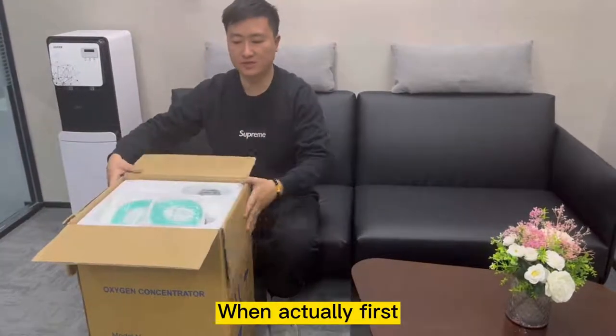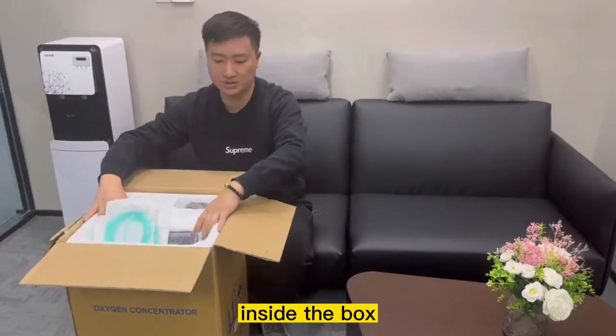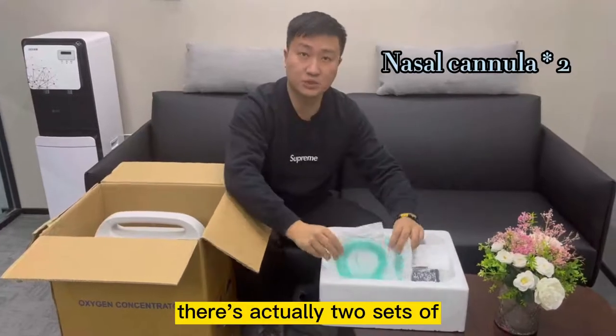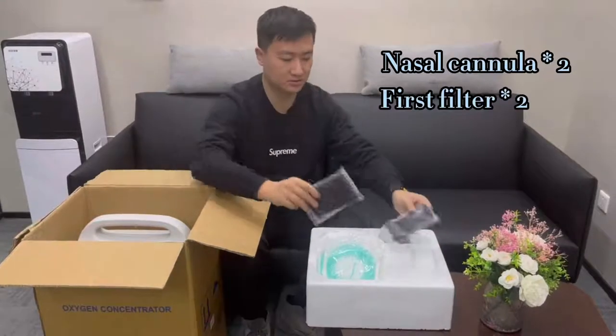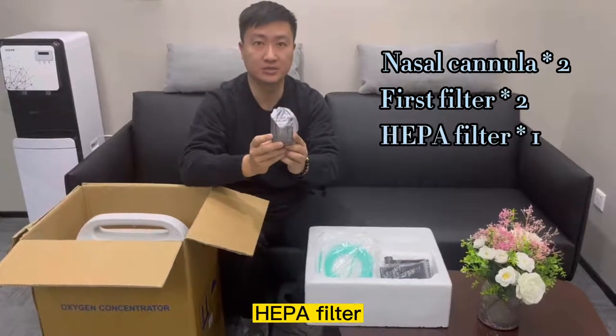We'll first open up the box and see all the accessories included inside. When you take the whole set out, you'll see that there are actually two sets of nasal cannulas included, two sets of our first filter, and one set of our high-efficiency type of filter.